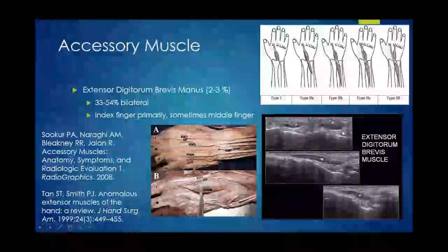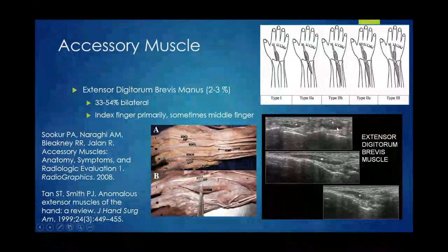Alternate pattern. On the short axis, you see the normal starry night appearance. Additionally, dynamically, you would see the muscle contracting and getting enlarged or smaller, depending on which way the contraction is occurring.